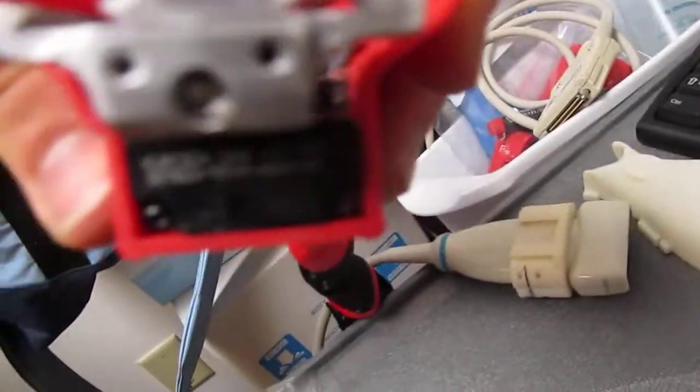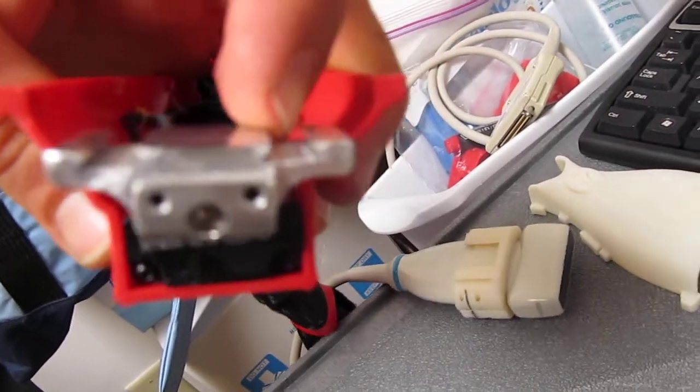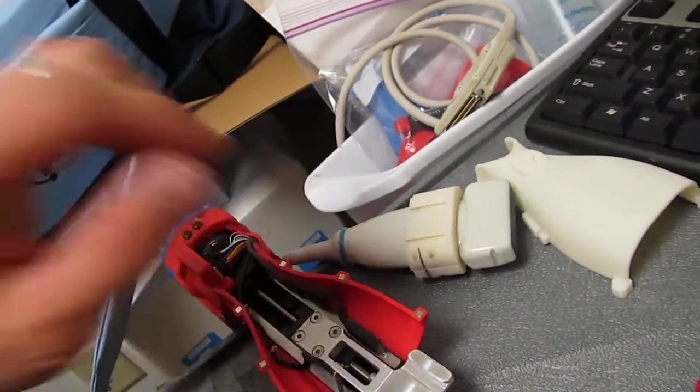This piece has a feature called a dovetail. You can see that it's tapered right here, and that matches up with these two grooves on the ultrasound probe itself.